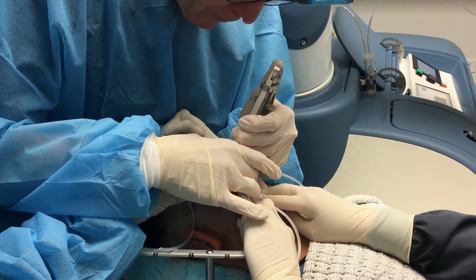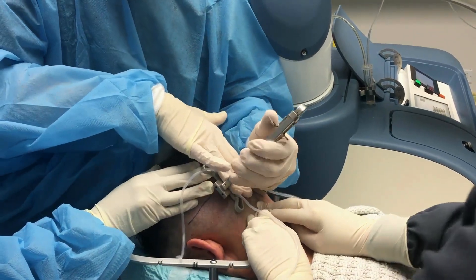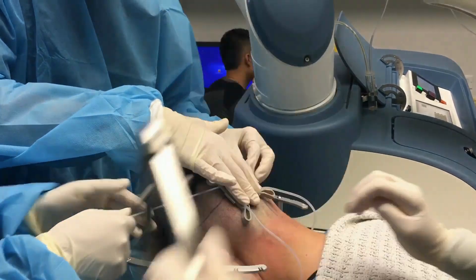Now I'm applying the tensioner to the third grid down, and this one is completely below the occipital protuberance.